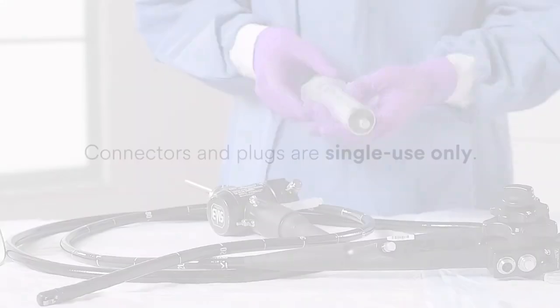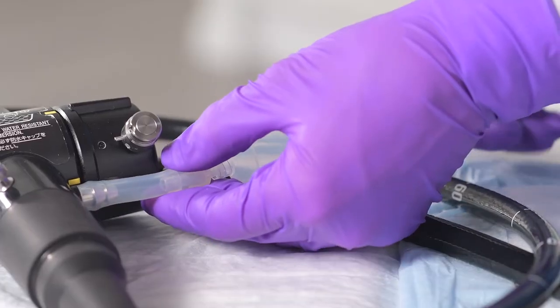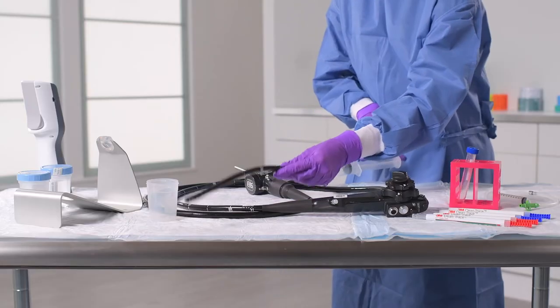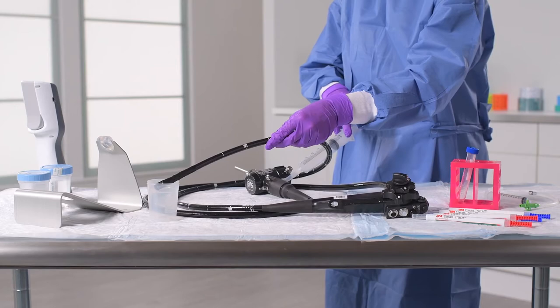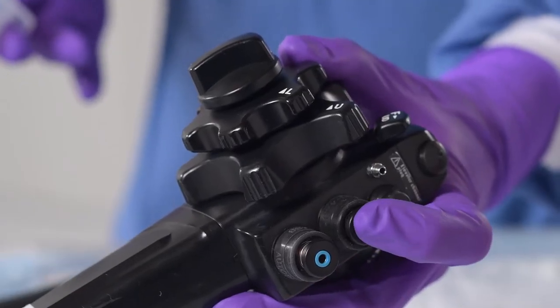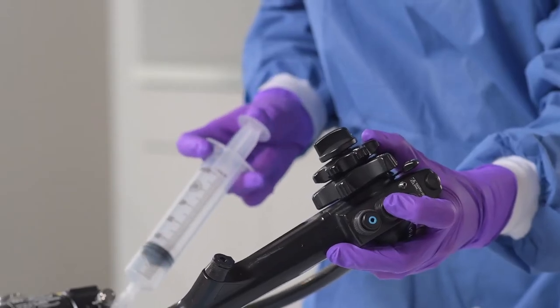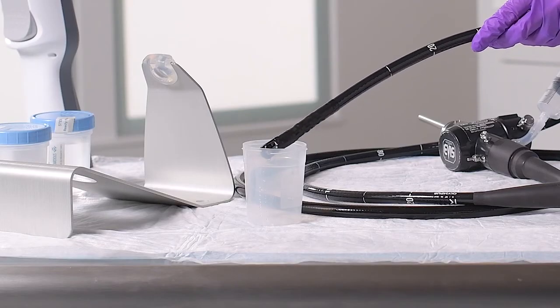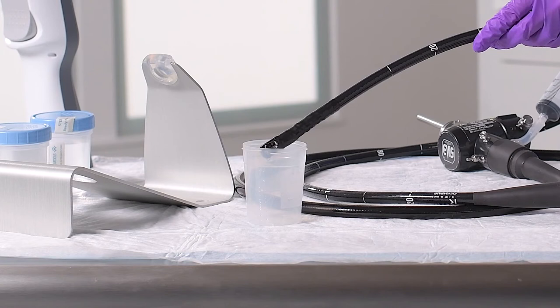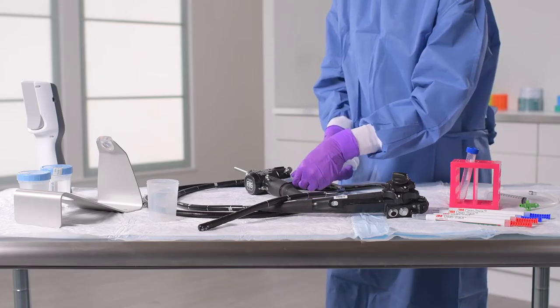Note that the connectors and plugs are for single use only, so be sure to discard them when you have completed your test. Next, fill a sterile 60cc syringe with air, then attach the syringe to the connector. If using the plug, press down on the syringe to push air through the channel. If using the suction valve, press down on the suction valve located on the control head — the valve with the red dot — then press down on the syringe. This air flush removes any remaining cleaning agent. Any fluid removed during this flush should not be collected in your sterile sample container. When complete, detach the syringe from the connector.